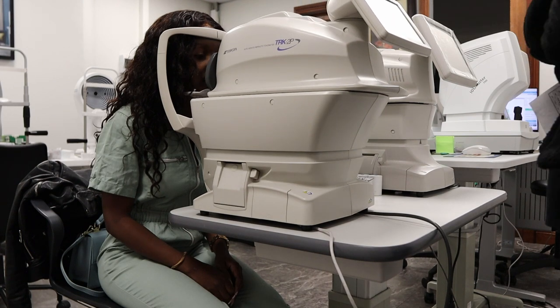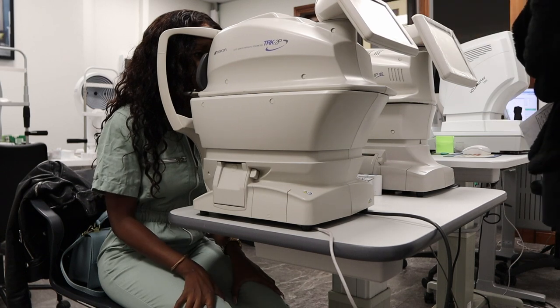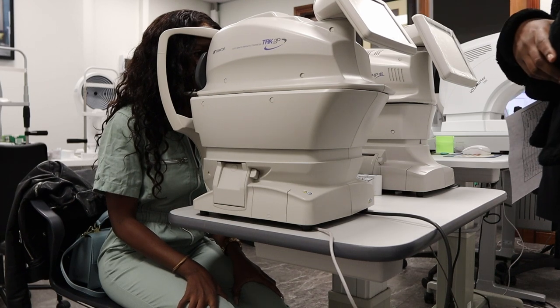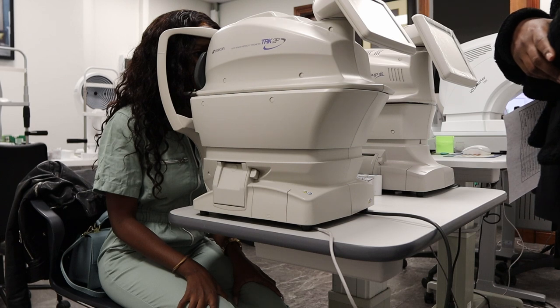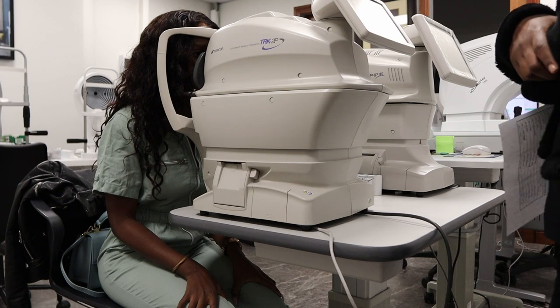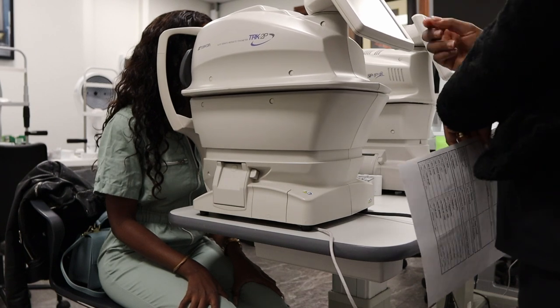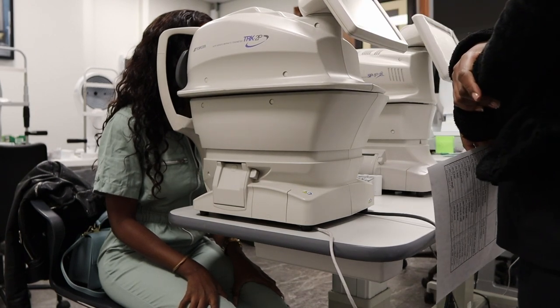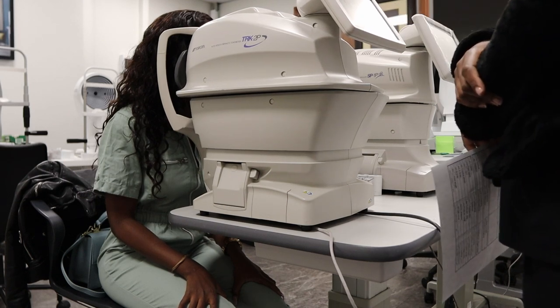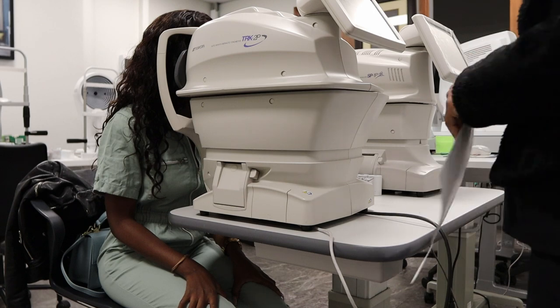Left eye. Now it's going to get your eye pressure. It's going to blow the puff of air three times into each eye. Just two more. Cool. Just one more. Cool. Now it's going to move to your right eye. Sure. Two more. Just one more. And then you can sit back, please.